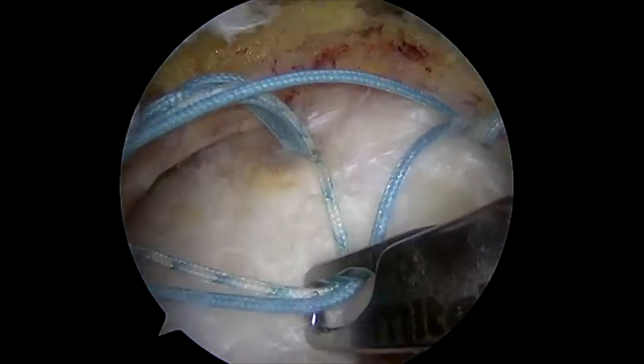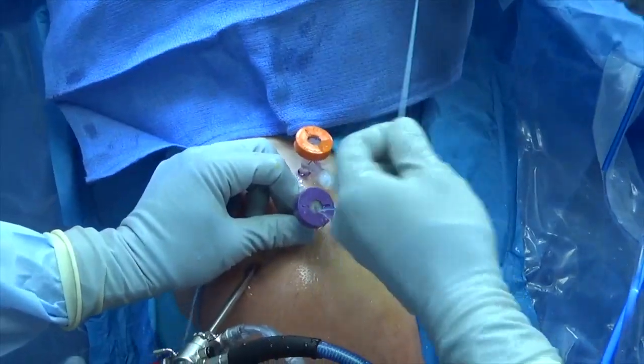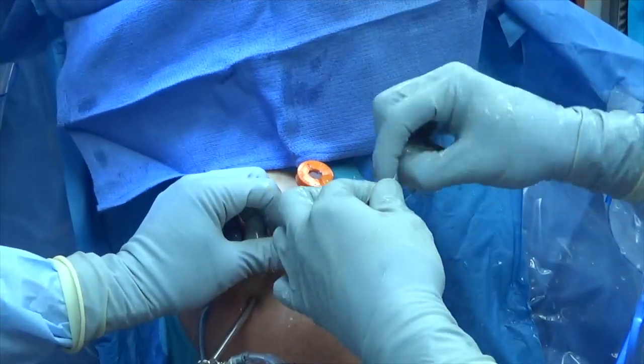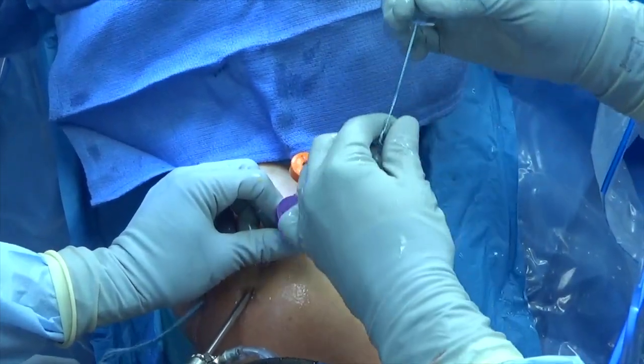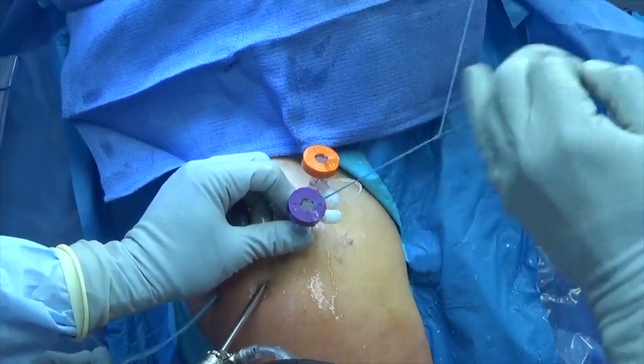One limb of each colored suture is retrieved out of the lateral portal. Sutures are tied together and a series of alternating half hitches are used to secure the knot.